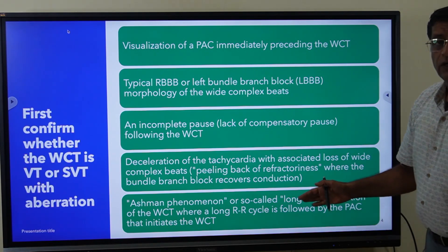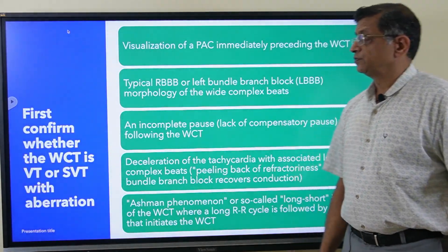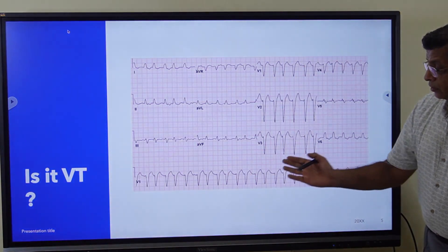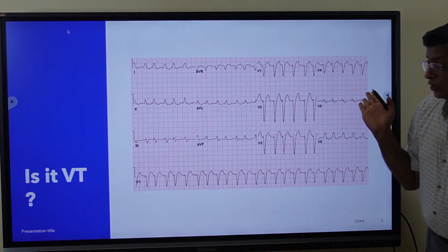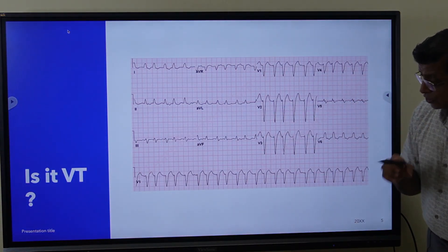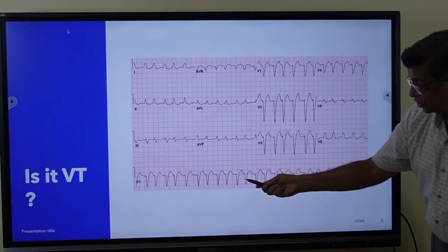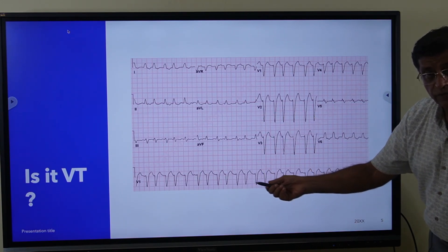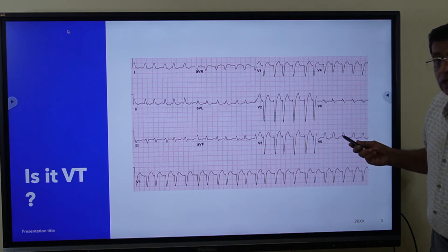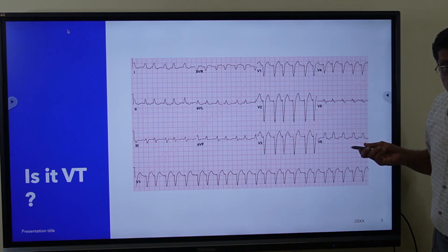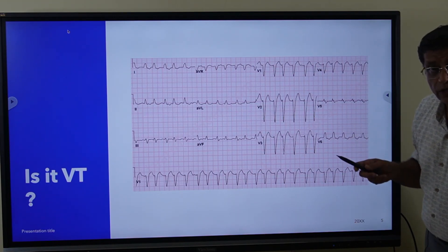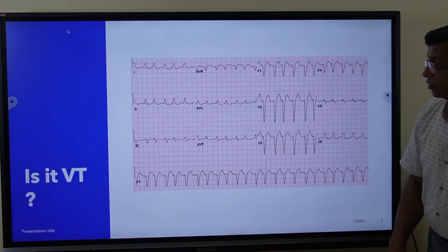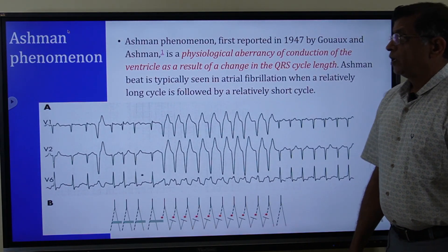Lastly, Ashman phenomenon — the so-called long-short initiation of wide complex tachycardia. Now, looking at this rhythm: the RR intervals are changing and there are no P waves, so this is atrial fibrillation with left bundle branch block — a ventricular aberrant conduction with a supraventricular rhythm. This is not ventricular tachycardia.